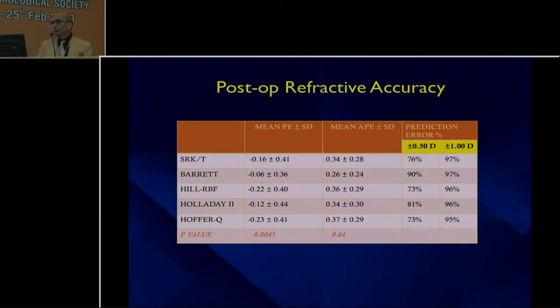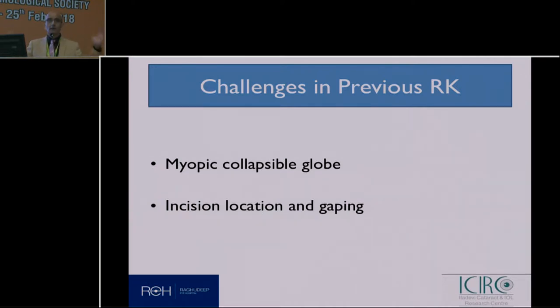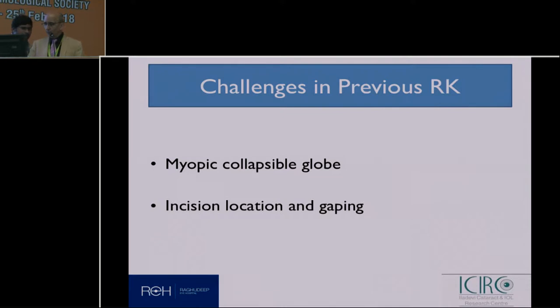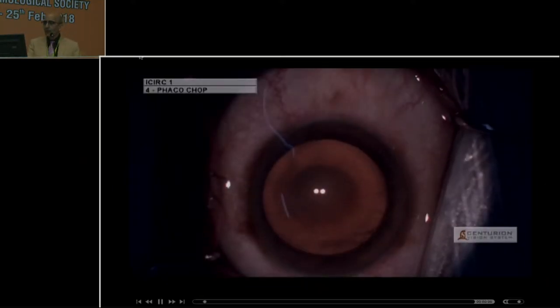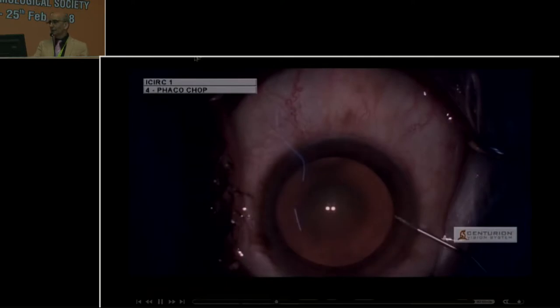We find that Barrett-True-K is good, but it is the surgery itself that we as surgeons are interested in. Remember, many of these patients have a compliant globe — the rigidity of the sclera is very collapsible. You also need to understand where you are going to locate your incision, because many of these incisions will gape.